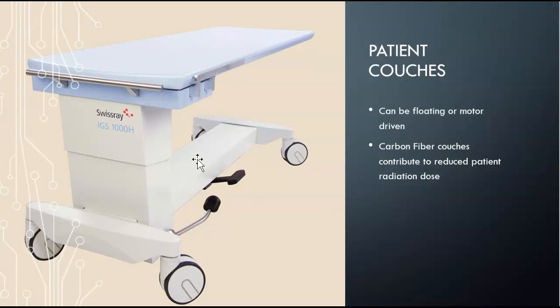Here is a floating table, so sometimes they're motorized, which is really nice. Most of the time they're not, though, so you just have to manhandle them, and we'll use these with C-arms quite a bit.